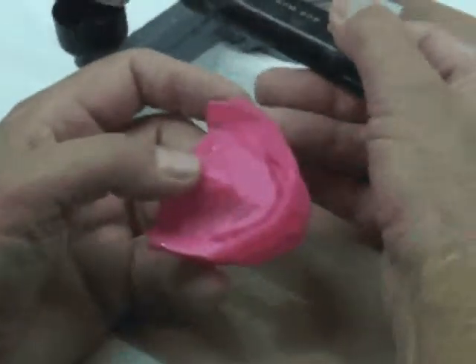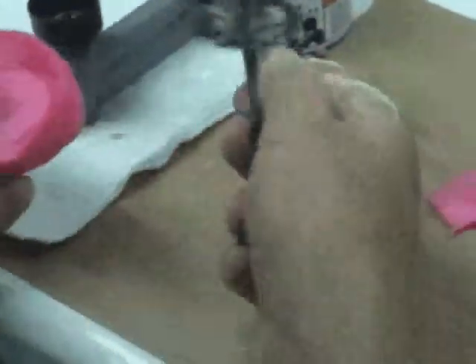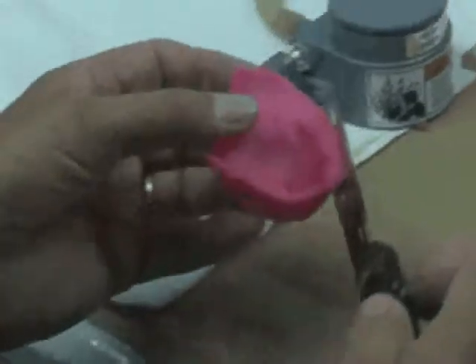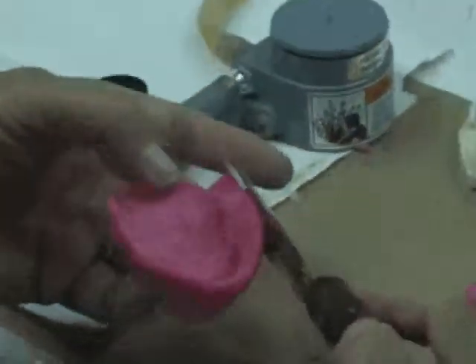You can tell when it gets hot when it starts to steam a little bit. Okay, now we're pretty hot. Now we're just going to go around and shape the periphery, and then start shaping the arch form. The arch form just follows the mucobuccal fold all the way around.